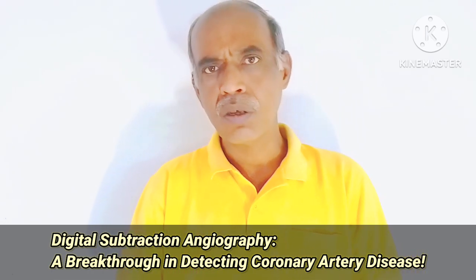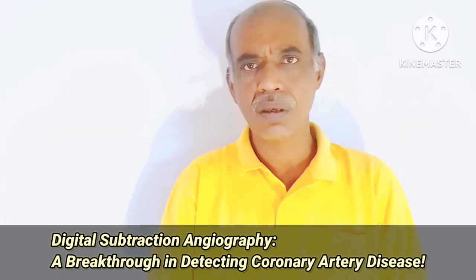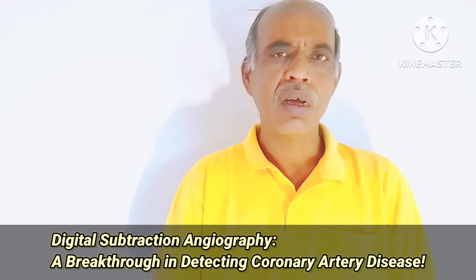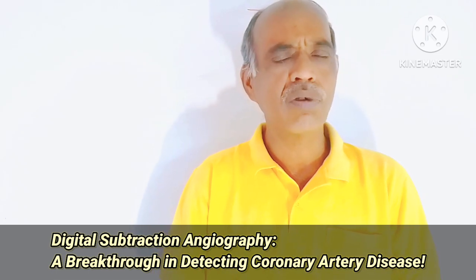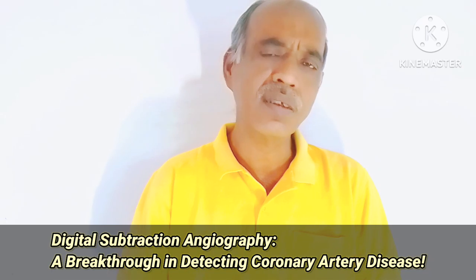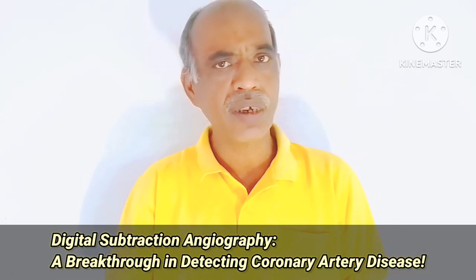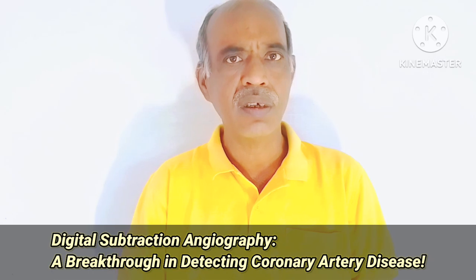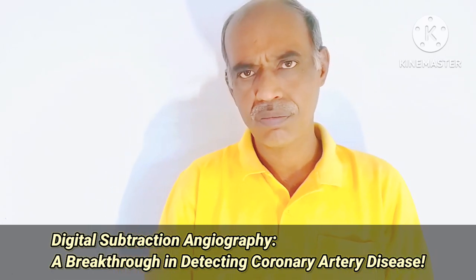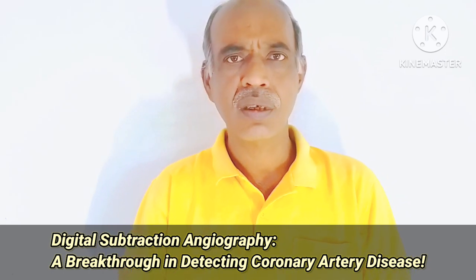That is the problem. Though this amount of radiation is smaller than in conventional angiography. There is an advantage, and again a disadvantage. Since radiation is present and multiple X-rays are taken, risk is involved. That is the disadvantage of this imaging technique.